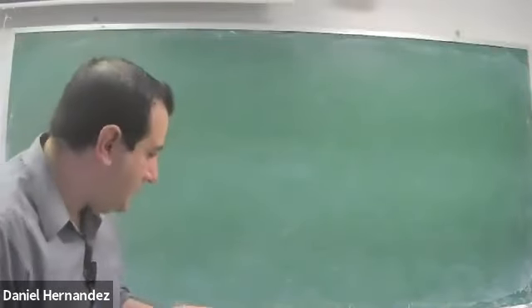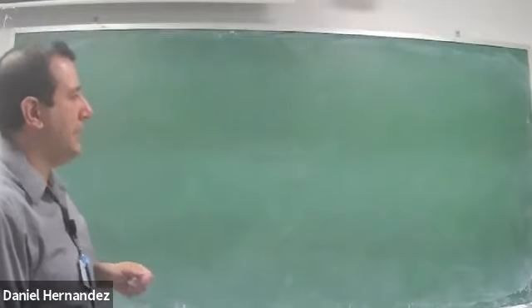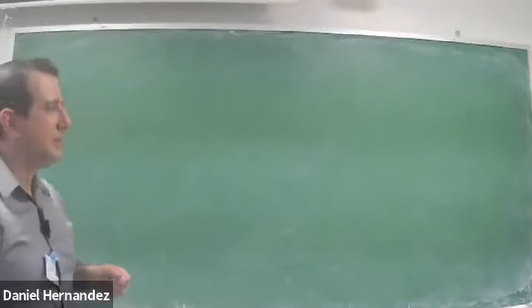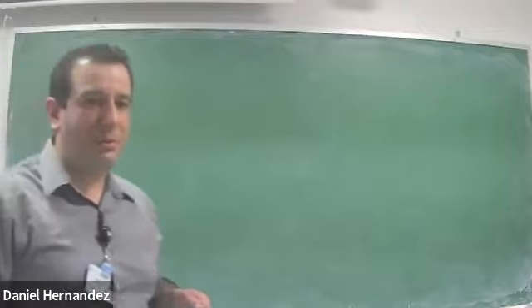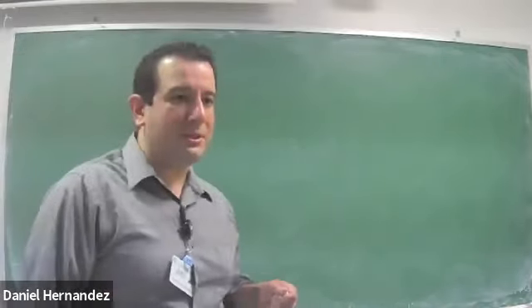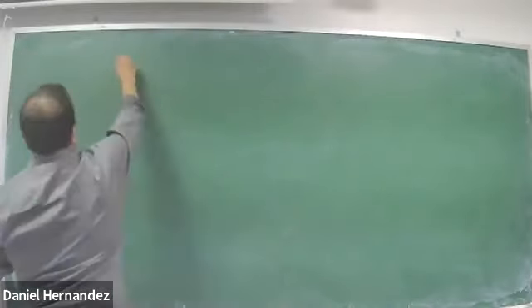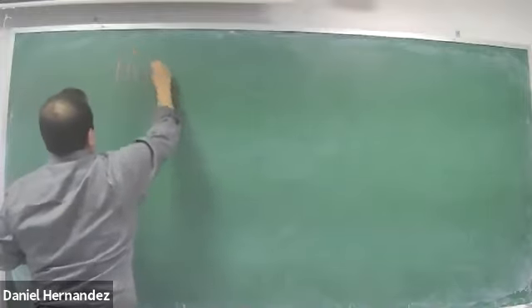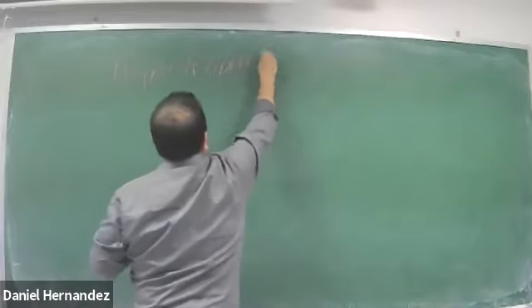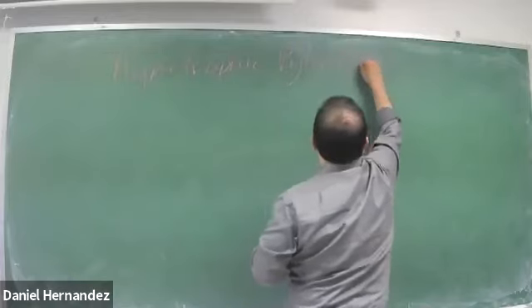All right, so the last surgical procedure or potential examination that could require surgery in the pediatric population that is common for us sonographers would be ruling out a condition called hypertrophic pyloric stenosis. Red. Why not? Let's switch off and do some red. Hypertrophic. Stenosis.